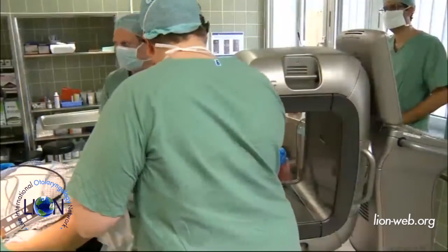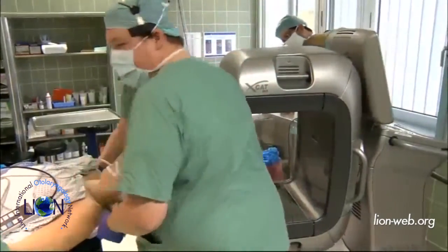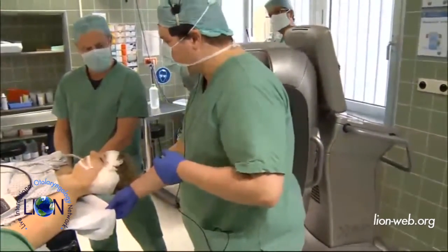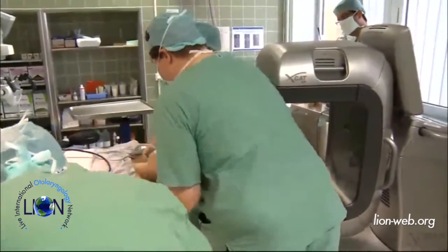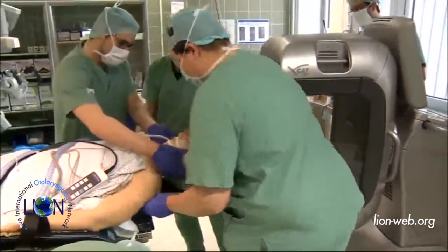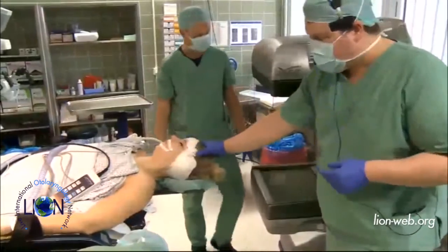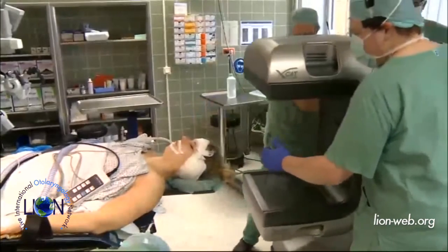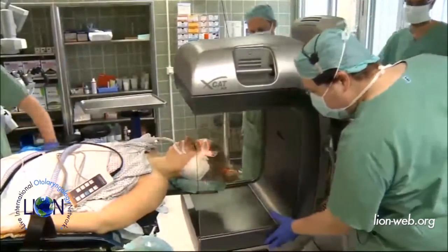We just have to pull the patient a little bit more in the head direction. The problem is we need a little bit of space just to go around the head, not to be too close to the body.